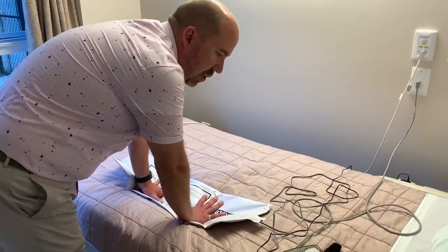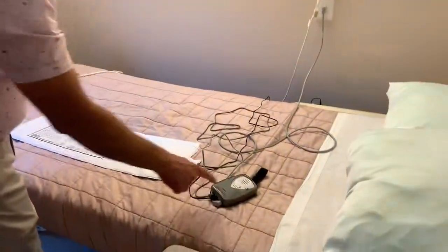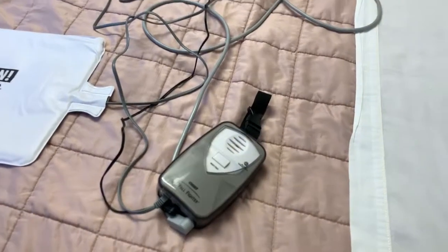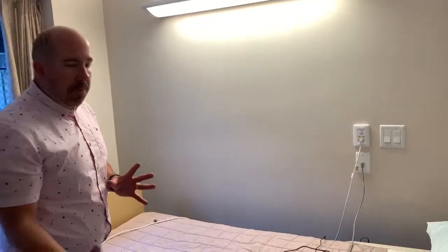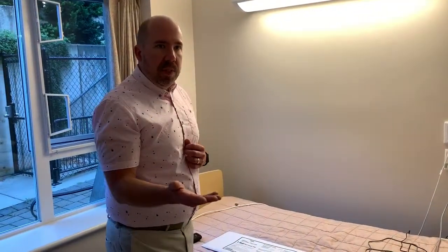What you're going to do is you're going to get them off the bed, and then within 2 seconds, you're going to press that reset button on the front. And that made it so that we're not getting a call on the phone right now. We were able to bypass it. The key is, though, you have to first lift the resident off the pad and then press the reset button within 2 seconds of getting them off the pad to avoid an alarm going through. That's how you reset that.